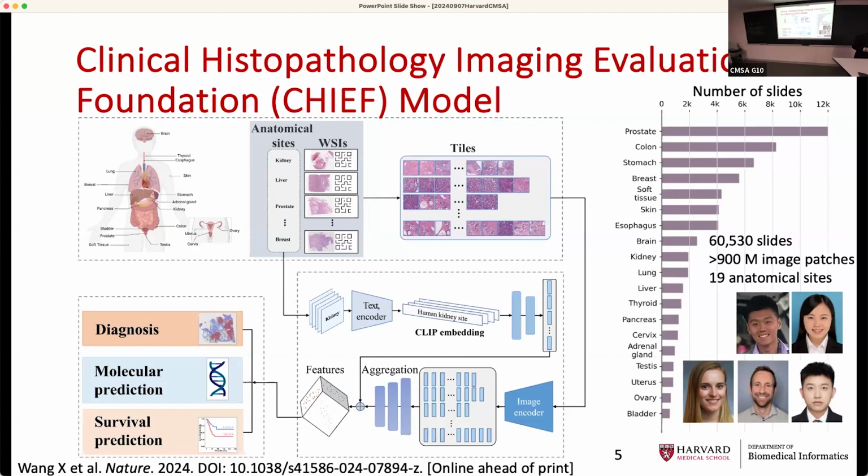So it's not easily applicable if we just dump all this information into an off-the-shelf machine learning model like those inspired by ImageNet. So we have to do something more creative. And our approach here is, starting from the whole slide image, this high-resolution view with billions of pixels, we first tile them into individual image patches, and then we feed them into some image encoders to extract features from those images.